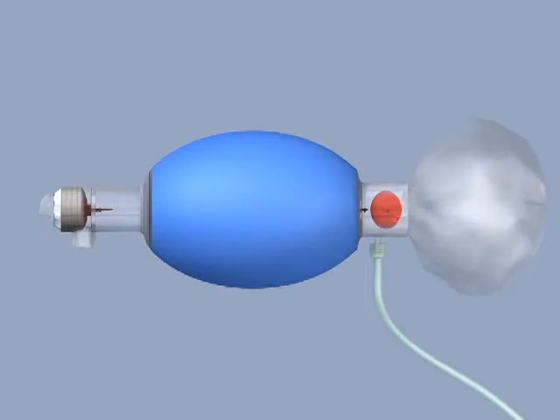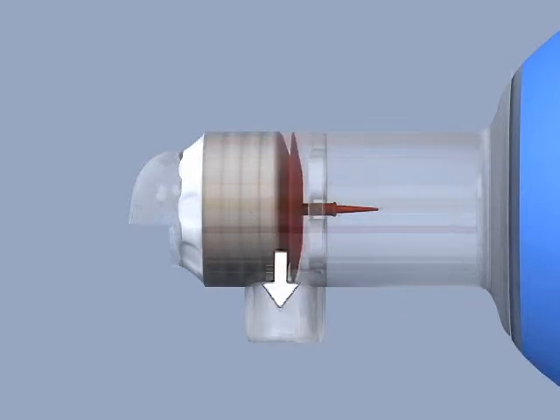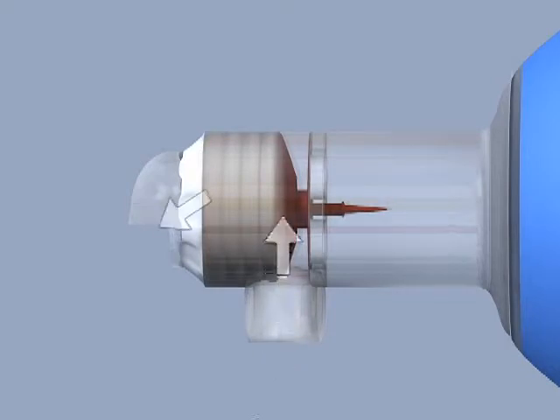oxygen, a series of one-way valves that prevent the entrapment of room air during ventilation, and the bag itself, which is squeezed to deliver breaths to the patient. Note that when the bag is squeezed, the valves allow oxygen to flow from the device to the patient. Exhaled gases are prevented from re-entering the bag and are instead diverted through an exhalation port.